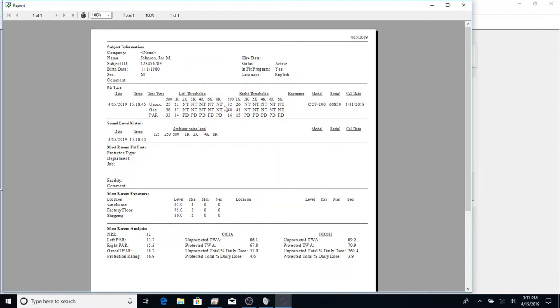Also, the test can be configured to test occluded or unoccluded first. In this situation, we demonstrated doing unoccluded first and then occluded. However, if you wanted to pull your workers straight off the factory floor, test them with their earplugs in, and then have them take it out and do another test and look for the difference, that would also work.